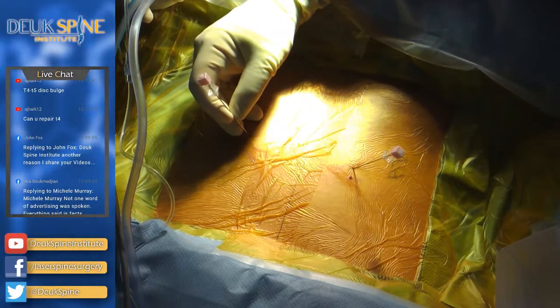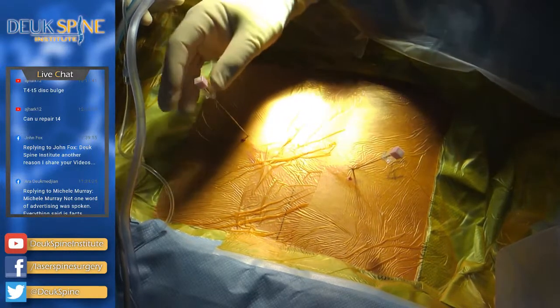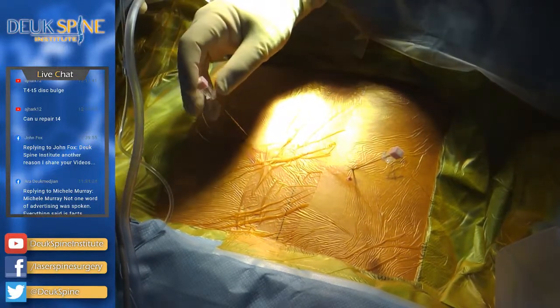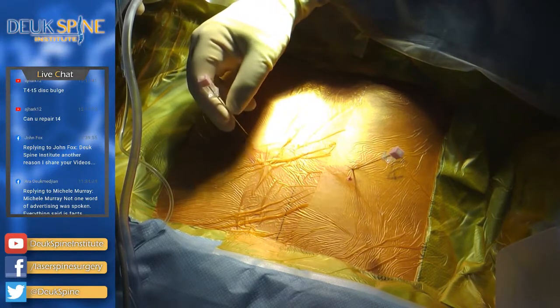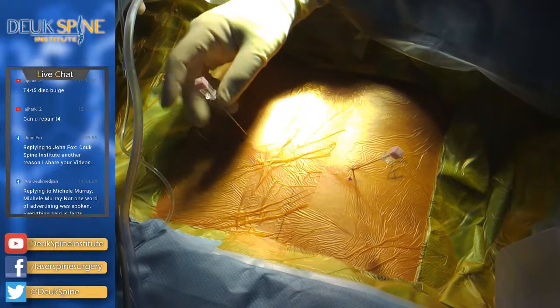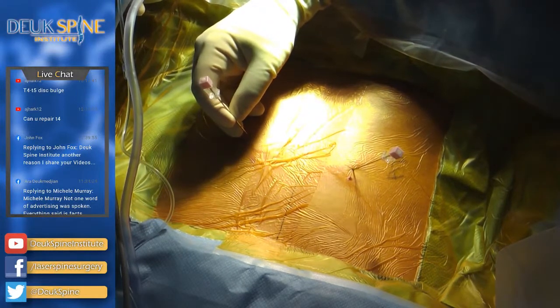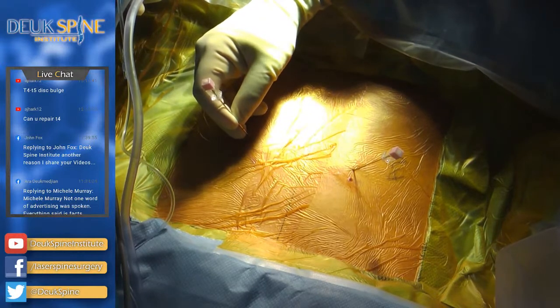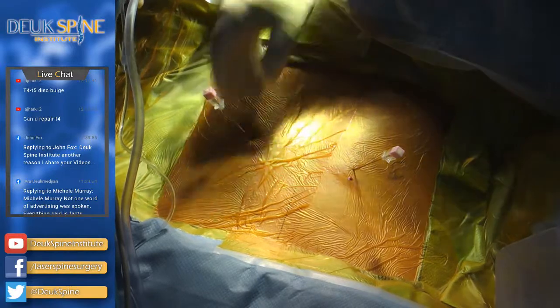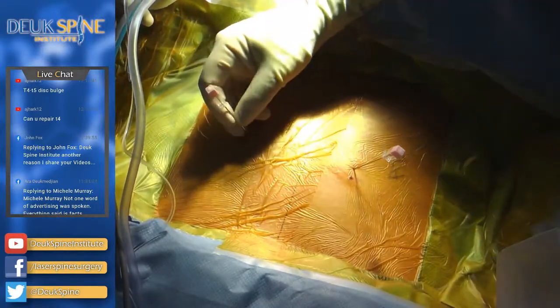All right. So we're at the second herniation. I can feel it with the tip of my needle. Do you feel anything in your back? Is that where your pain comes from, your thoracic pain? Yeah, I'm right on the herniation. It's actually worse on the right side than the left for some reason. It's bigger here. We know it's asymmetric. Shot? All right. Are you comfortable?